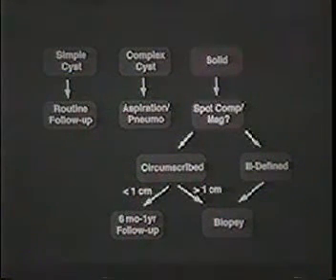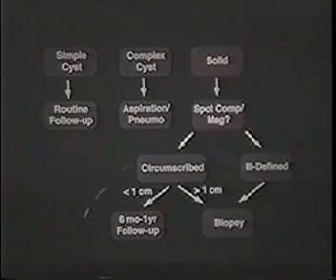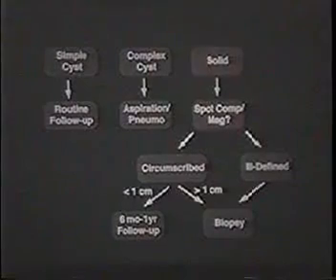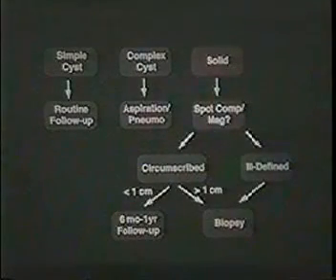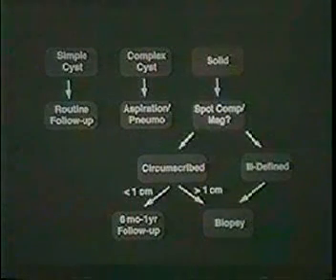And the decision about what to do with these cases is still being worked out in terms of evidence in the literature. Dr. Sickles has written a paper about it, and there will undoubtedly be others, because this particular track of the algorithm still needs to be worked out more carefully, but there are guidelines in various practices, and for most cases, if it's a very small circumscribed mass, we would follow it. If it, however, is ill-defined on the magnification spot compression views, we'd go on to biopsy, and that would usually be a core biopsy.